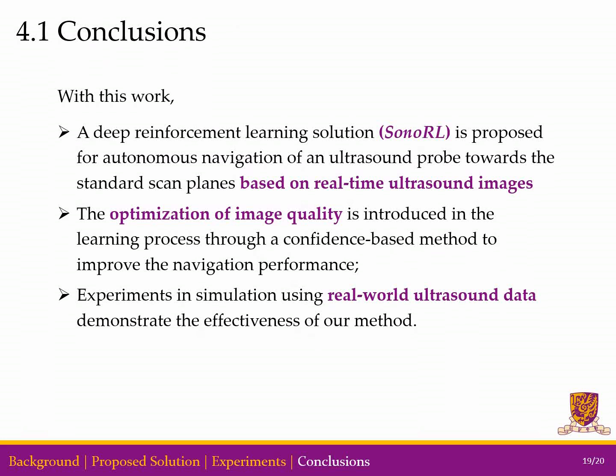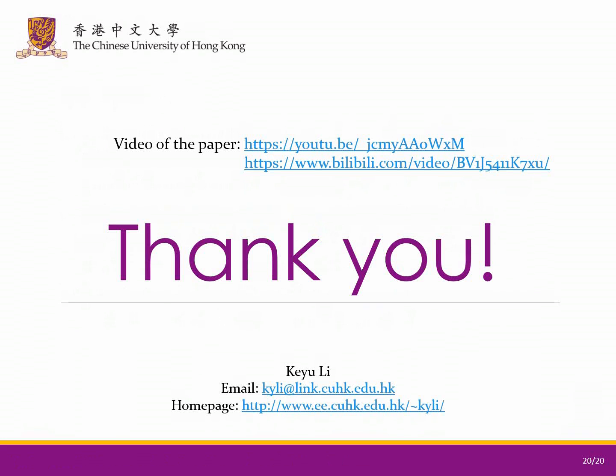In conclusion, with this work, a deep reinforcement learning solution is proposed for autonomous navigation of an ultrasound probe towards the standard scan planes based on real-time ultrasound images. The optimization of image quality is introduced in the learning process through a confidence-based method to improve the navigation performance. Experiments in simulation using real-world ultrasound data demonstrate the effectiveness of our method.